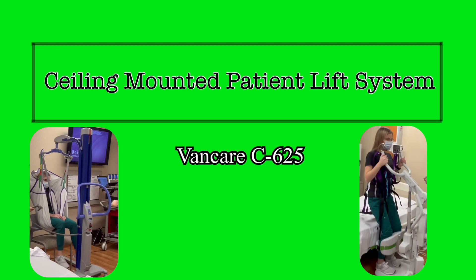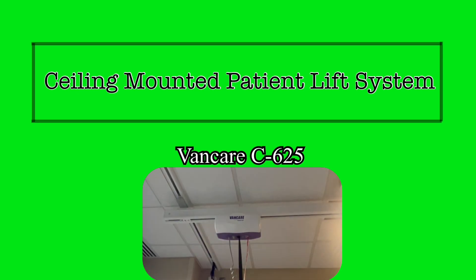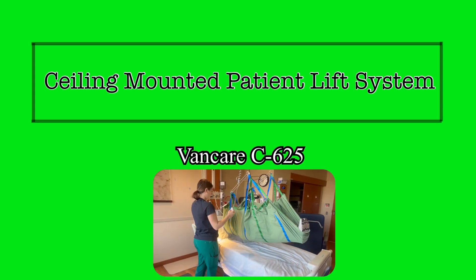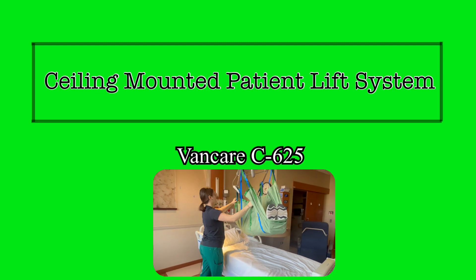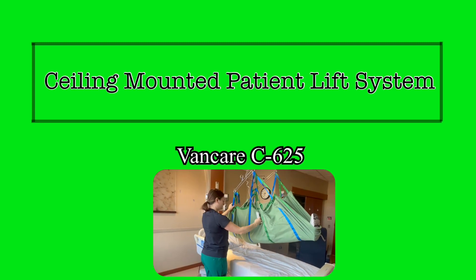Powered patient lifts allow for the easy transfer, repositioning, and mobility of patients, and eliminate risk to the caregiver. There are multiple options available at Trinity Health Livonia, including the MaxiMove and the Sabina Sit-to-Stand device, but rooms in the South Tower of Trinity Livonia are designed with a mounted lift system built into the ceiling. This lift system allows you to use a sling to lift, move, or reposition patients in the room. This video will review the ceiling lift system and demonstrate use of these devices.